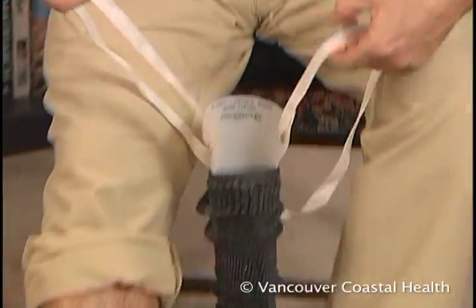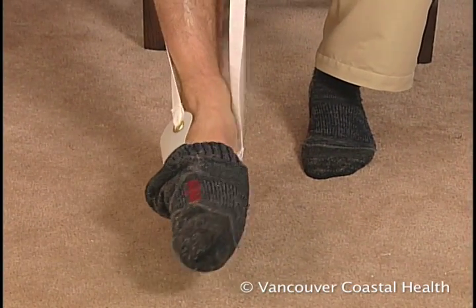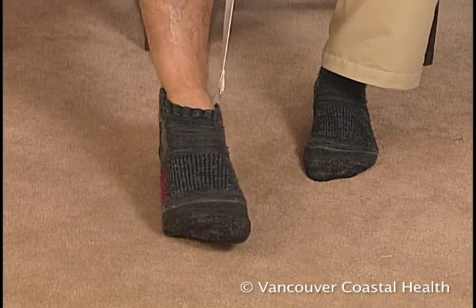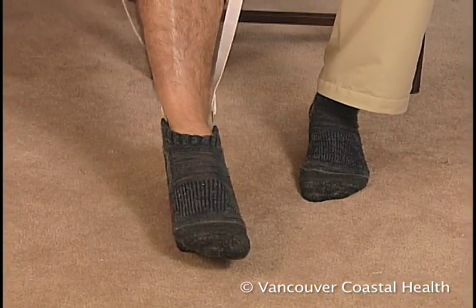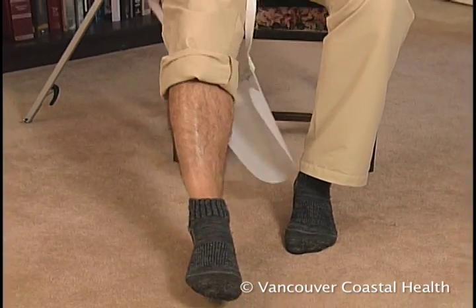Hold onto the string and place the aid on the floor. Slowly work your foot into the sock until your toes touch the end of the sock. Now pull on the strings — the aid slips out and the sock moves onto the foot.